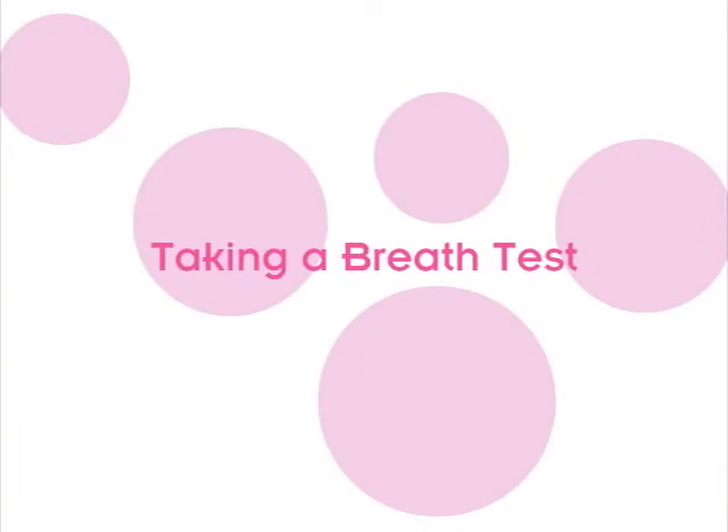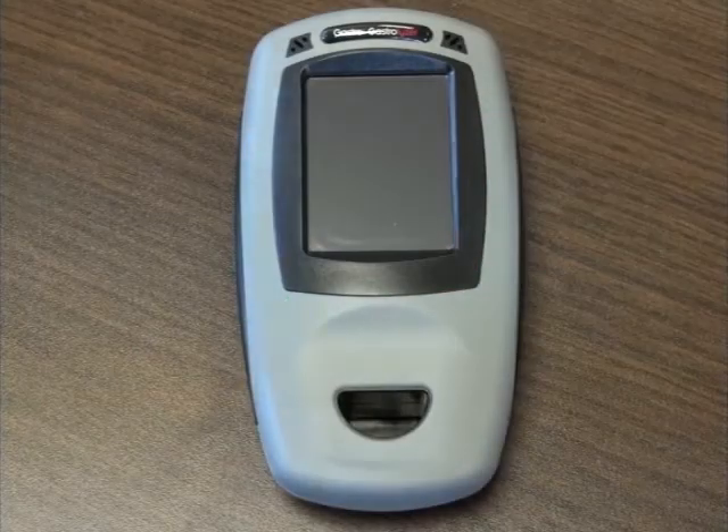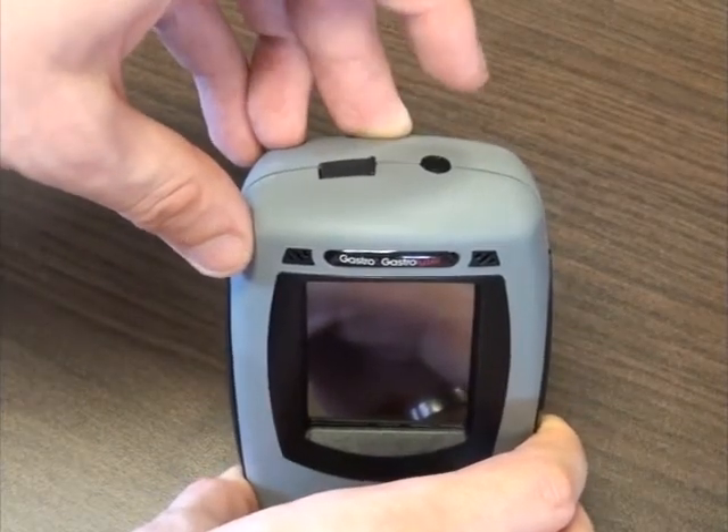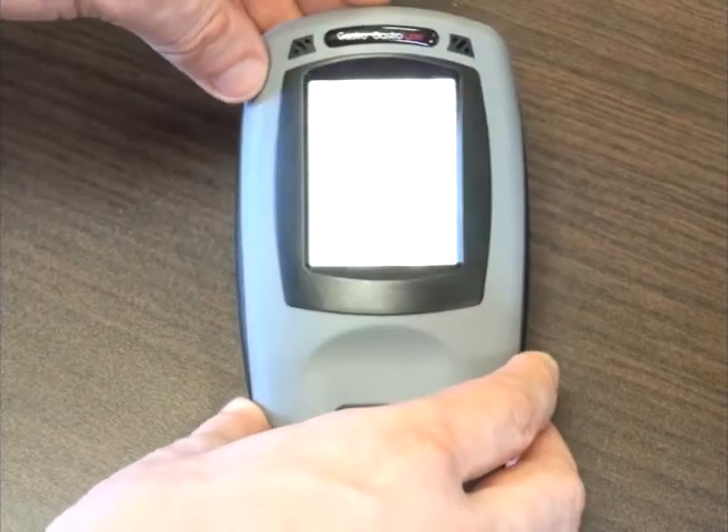Taking a breath test. To switch on the Gastroplast Gastrolyzer, press and hold the on-off button located at the top of the monitor for a few moments.